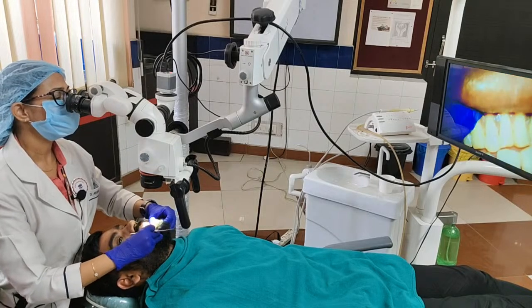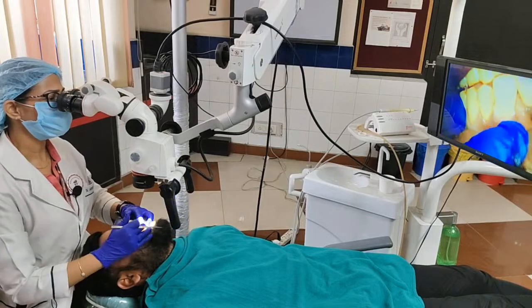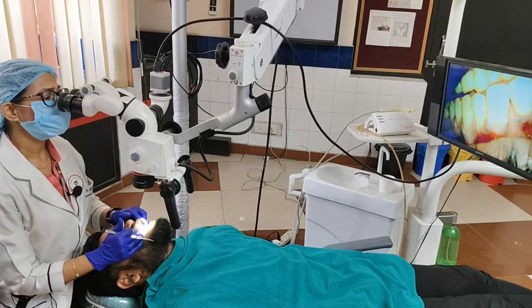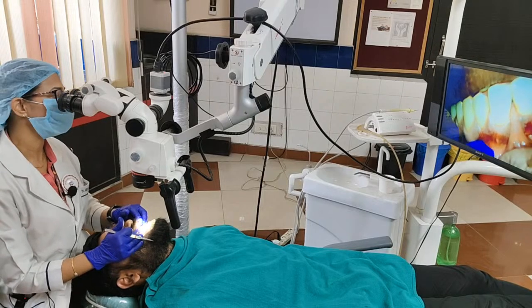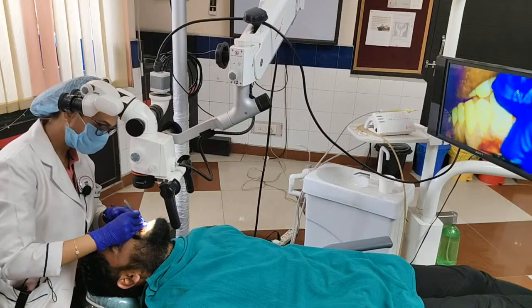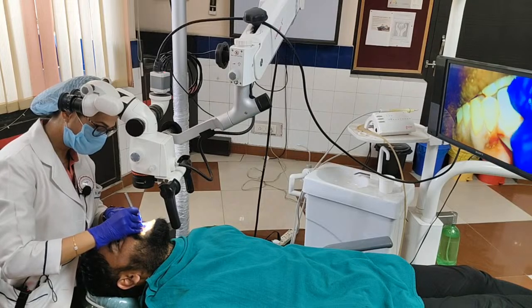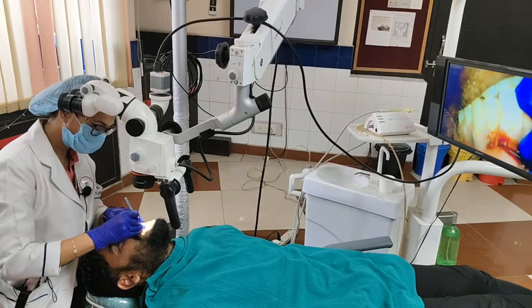In scalpel, you have an option of either putting a surgical dressing or not. It's up to the patient's comfort. Right now, there is not much bleeding, and enough hemostasis is attained. So I would rather not place a pack over there. Just advise the patient, give proper post-op instructions and proper medication, and that should do it.